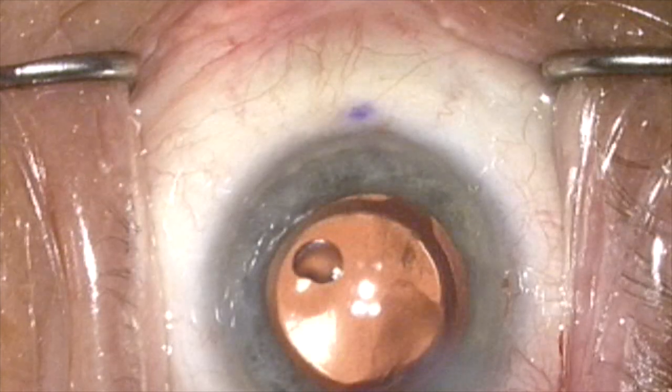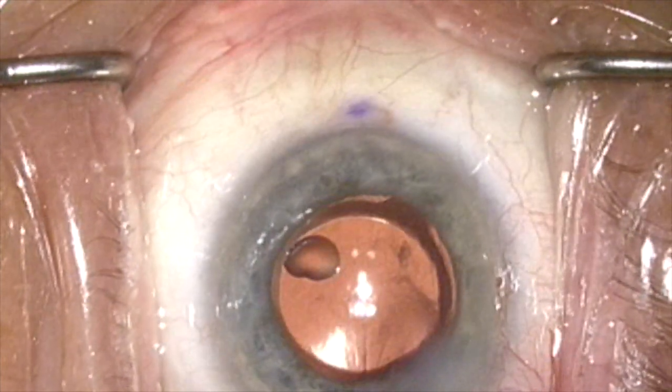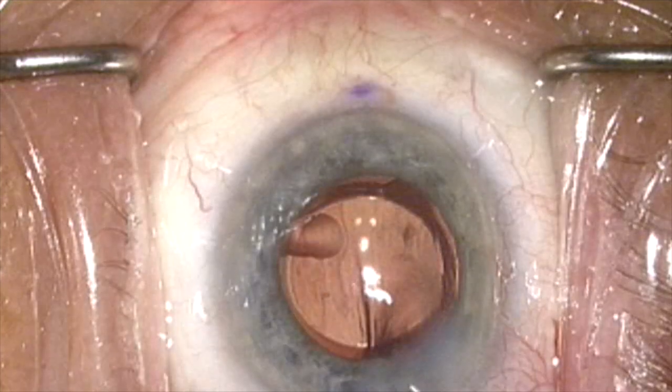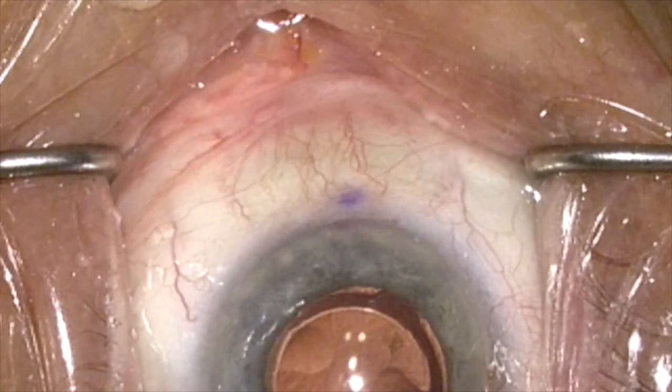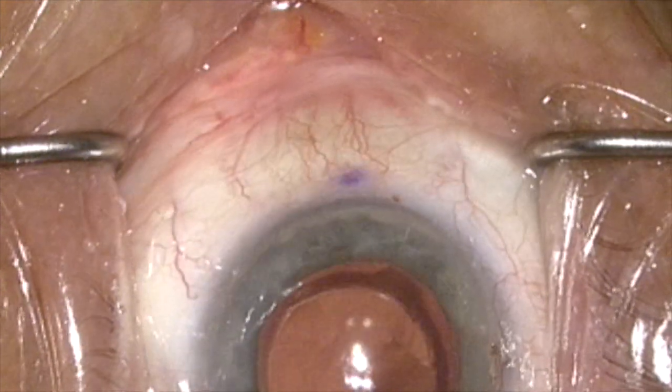But the question is, how do you know that it's really in Schlemm's canal? So here we've repositioned the microscope, removed the viscoelastic, and now we're softening the eye and focusing on the perilimbal aqueous veins.